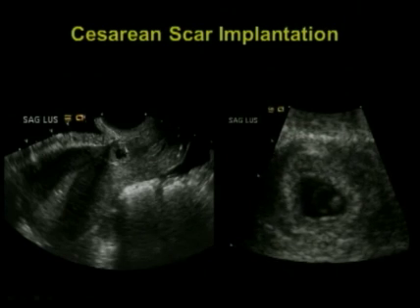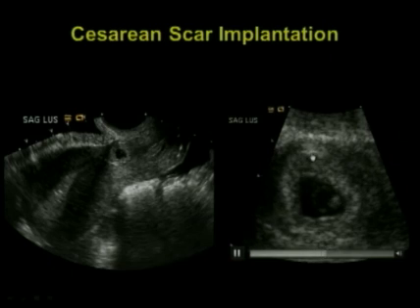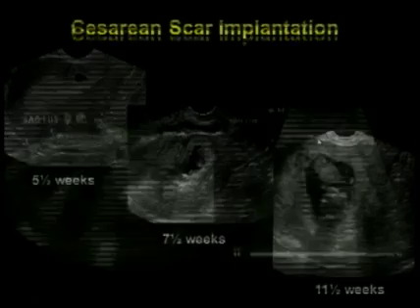You can see here the cervix ends around here, so the gestational sac is low in the uterus, just above the cervix. It looks like it's extending with the bright tissue all the way up to the serosal surface. When you look closer on this close-up view, you can see the bright echogenic trophoblastic tissue is actually extending not only up to the serosal surface, but even bulging it. This is a Cesarean scar implantation.